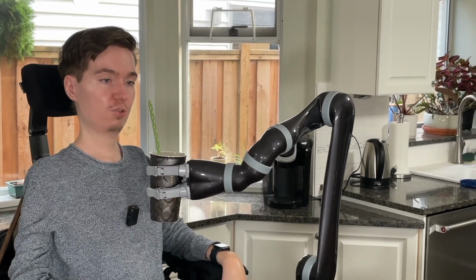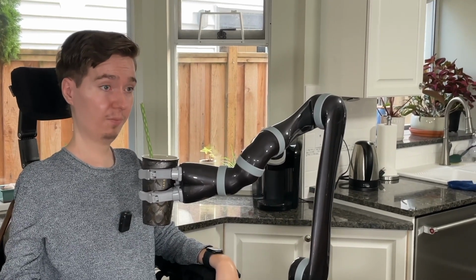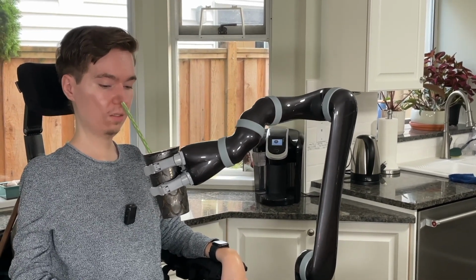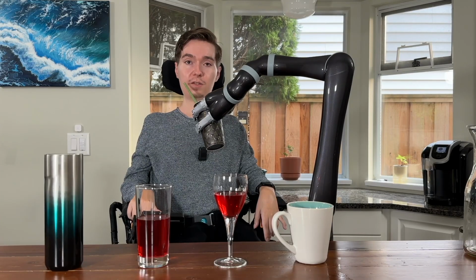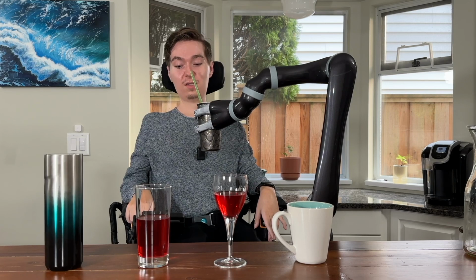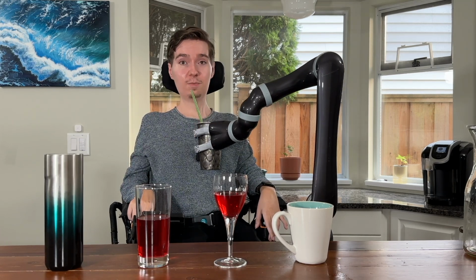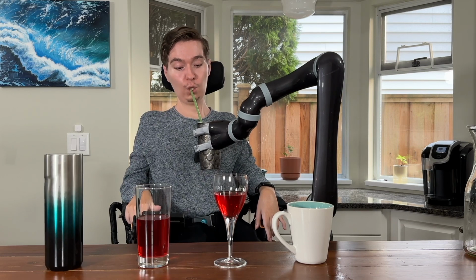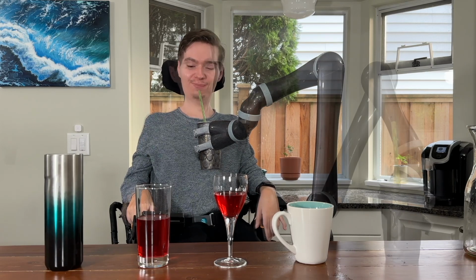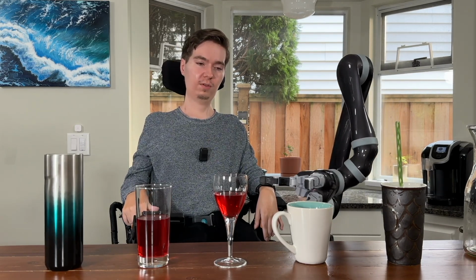Now you might find that the straw is not in the right place for you to be drinking from, and you can solve this by just tilting Jaco a little bit using mode B3, and that's going to tilt the hand just a little bit. Just be careful that you're not pouring a very full cup onto your lap, because that would not be good. So now that this straw is in a good position, I'm going to take a drink. Very simple.